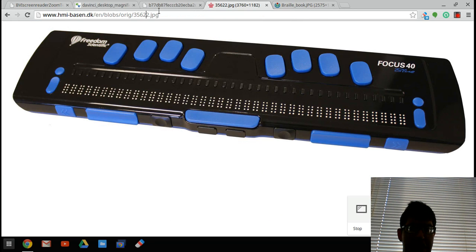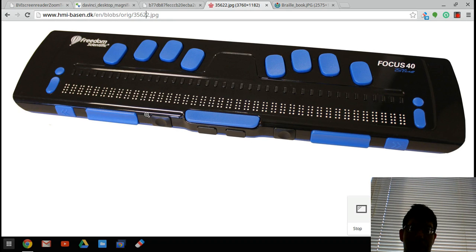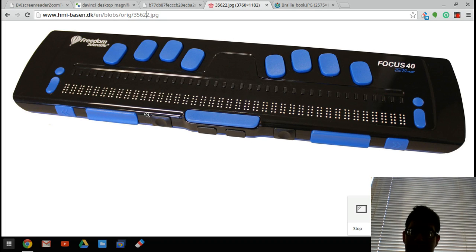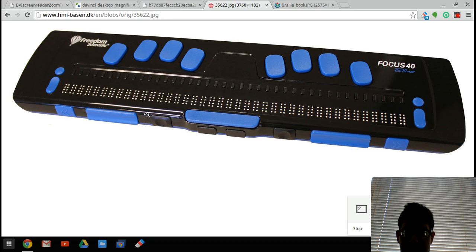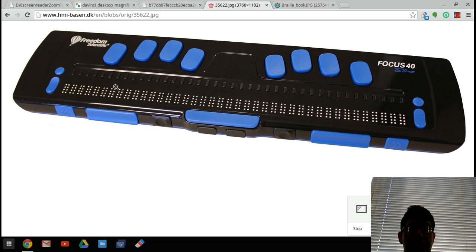And the way I see it is this technology is expensive, especially the Braille displays, because there are more people out there who do have some usable vision and would most likely use screen magnification, like myself, and perhaps with speech supplement, than there are people who are entirely blind. And when I say entirely, I mean zilch, zero, nada, not even light. Those people are in an extreme minority, and people who are deafblind, who would be forced to use this Braille display because they can't even hear the speech, are an even smaller minority.